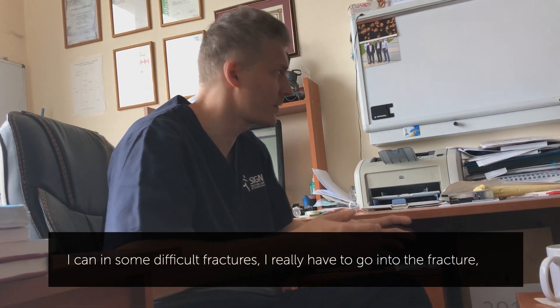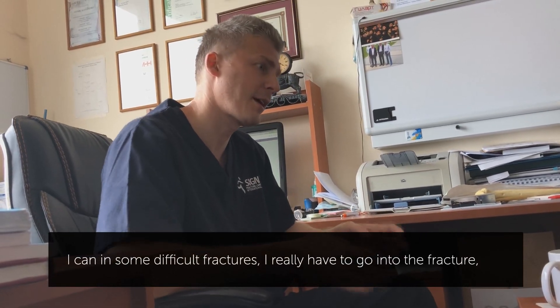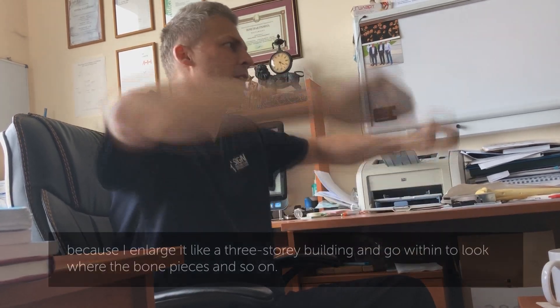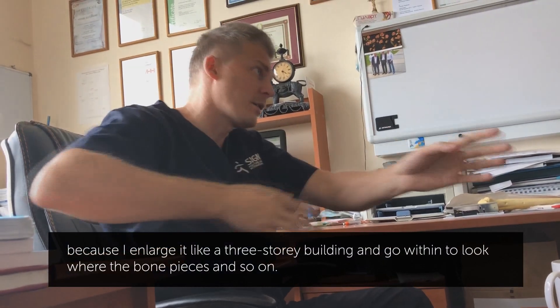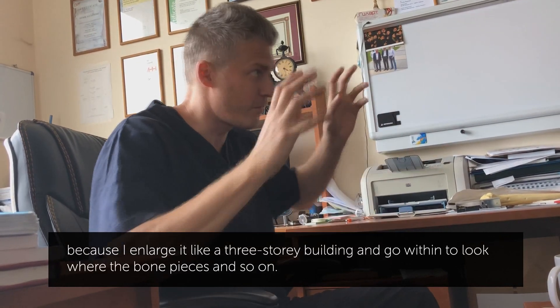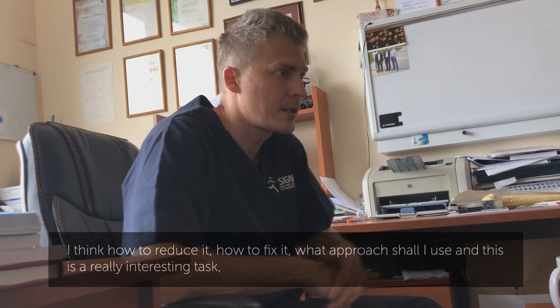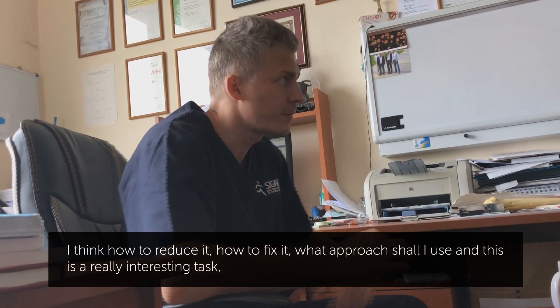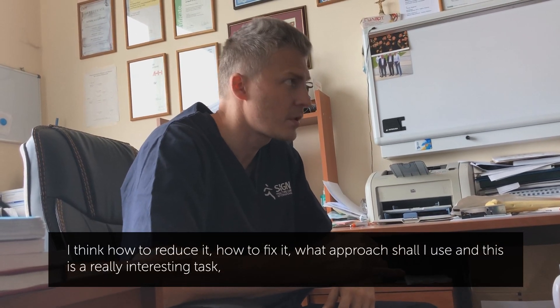In some difficult fractures, I really have to go into the fracture — I enlarge it like a multi-story building and go within to look at where the bone pieces are, think about how to reduce it, how to fix it, and which approach to use.